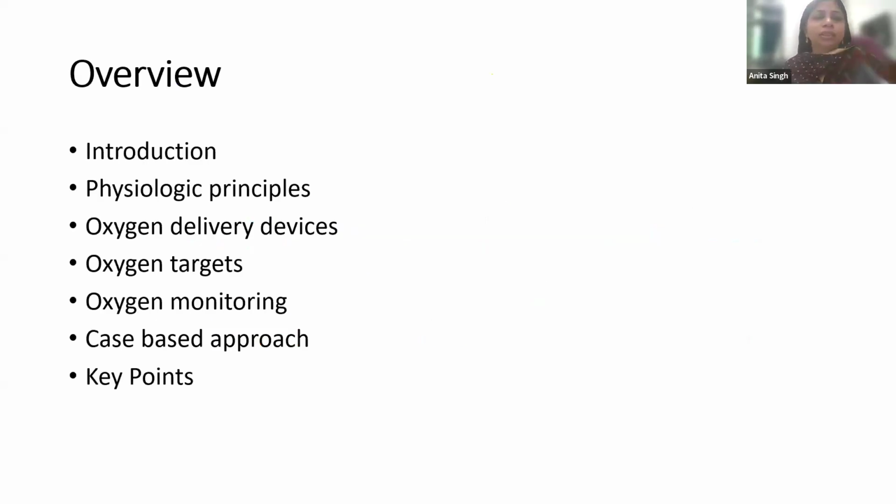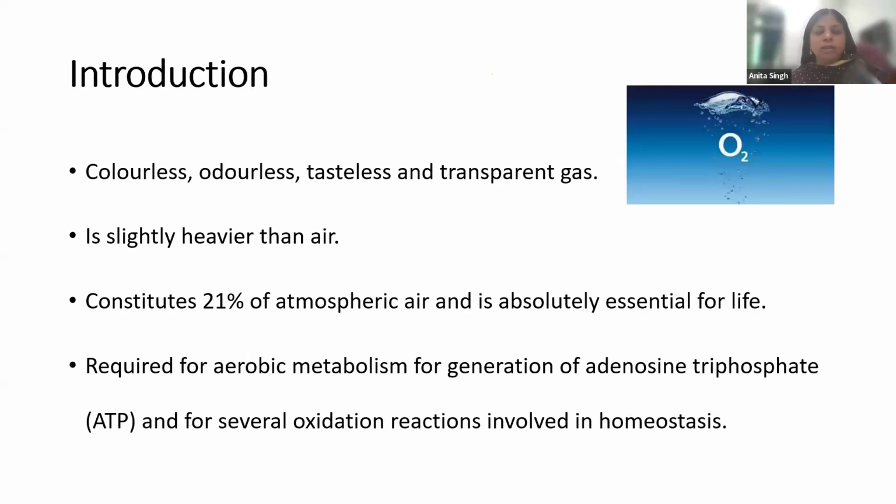So I would discuss in this presentation a brief introduction, a few physiological principles which are very important to know whenever we are dealing with oxygen therapy in newborns, oxygen delivery devices, targets, oxygen monitoring, and a few case-based scenarios. So as we all know, oxygen is a colorless, odorless, tasteless and transparent gas, slightly heavier than air. Approximately in room air, we have 21% of oxygen.